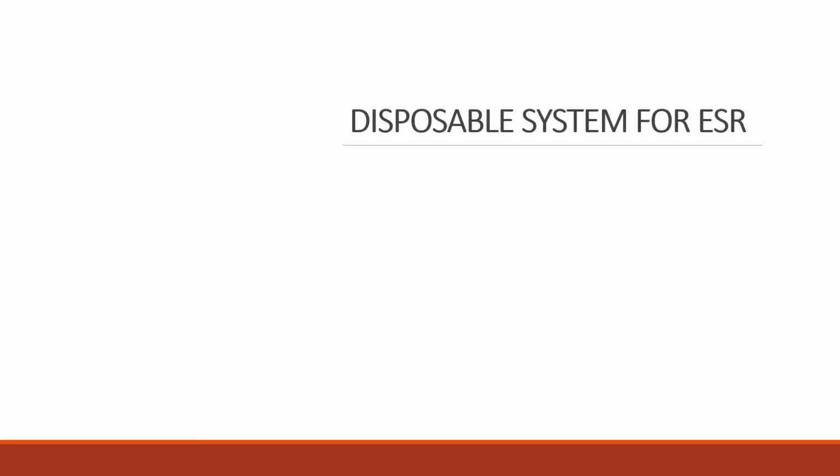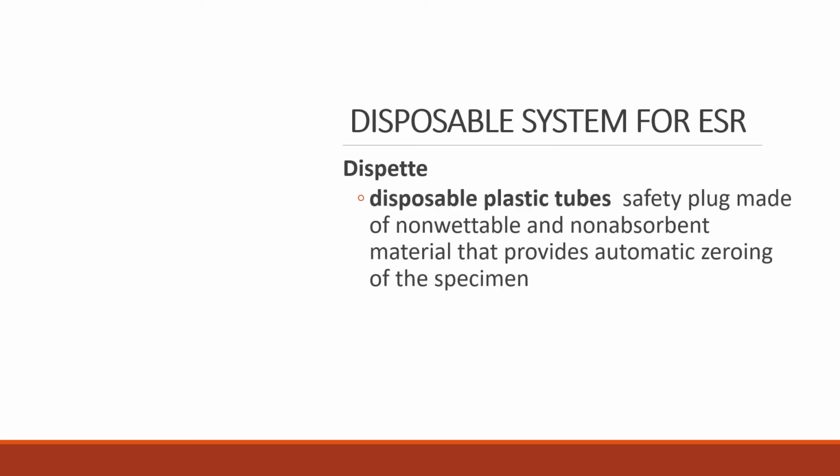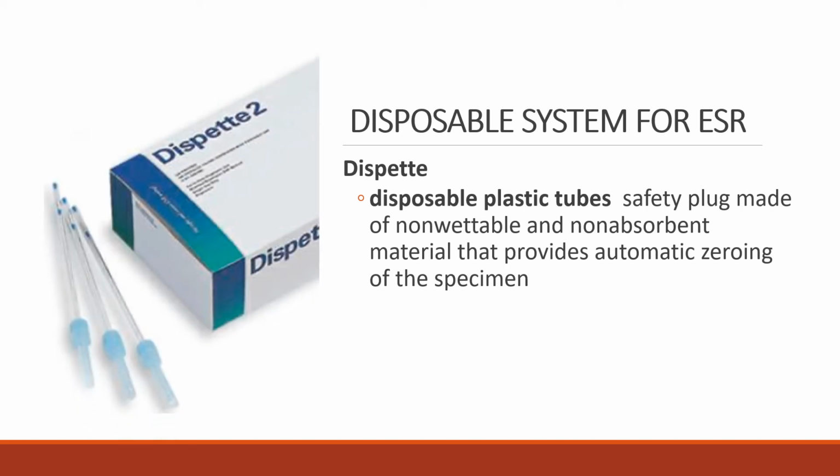We also have a disposable system for ESR determination in the form of the Dispette. This one makes use of disposable plastic tubes that are safely plugged and made of non-wettable and non-absorbent material that provides automatic zeroing of the specimen.